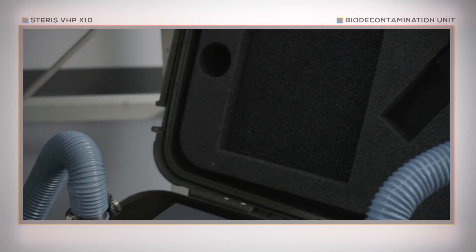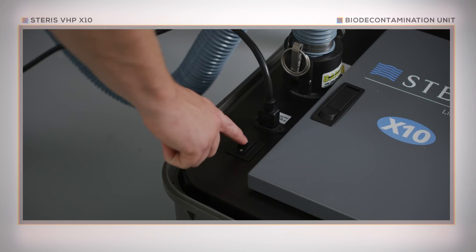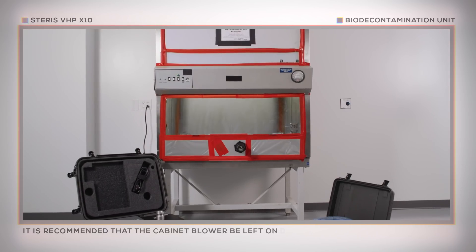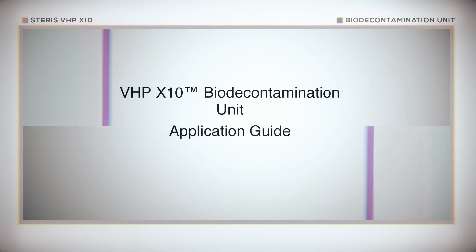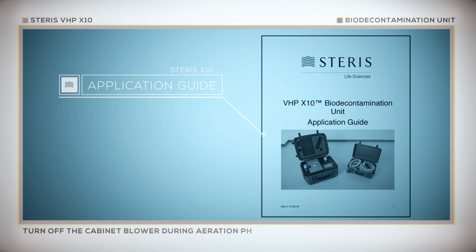After confirming that all safety procedures have been followed, turn the cabinet blower on and power up the X10 unit. If operational, it is recommended that the cabinet blower be left on during the preheating, dehumidification, and decontamination phases of the cycle. If the blower is not working, a longer cycle may be required. Check the Steris VHP X10 application guide for guidance. During the aeration phase, it is recommended that the cabinet blower be turned off, as this will minimize required aeration time.